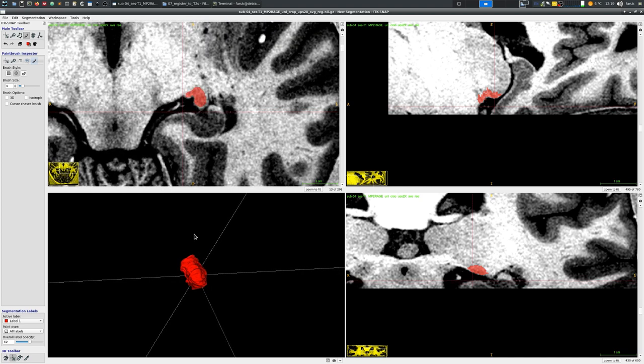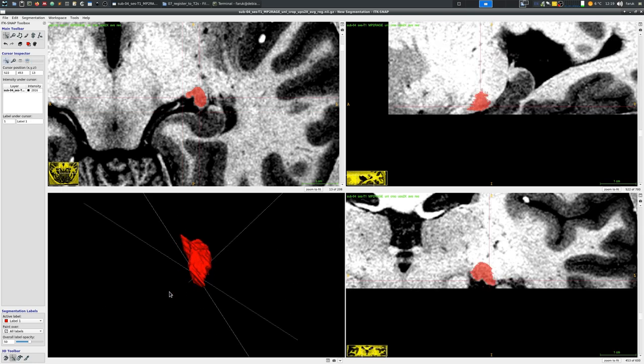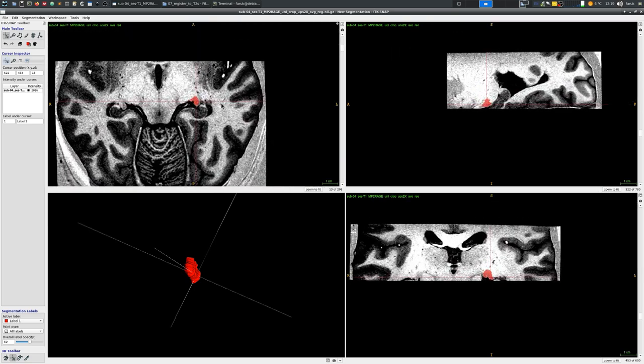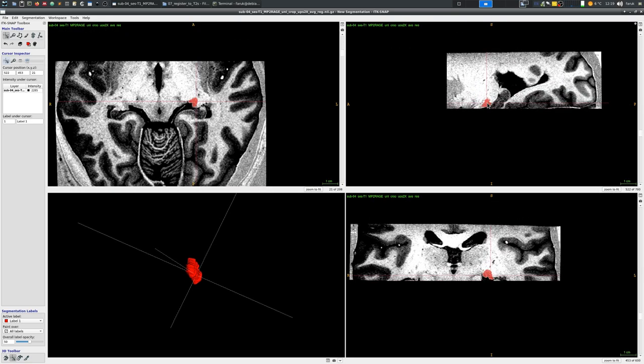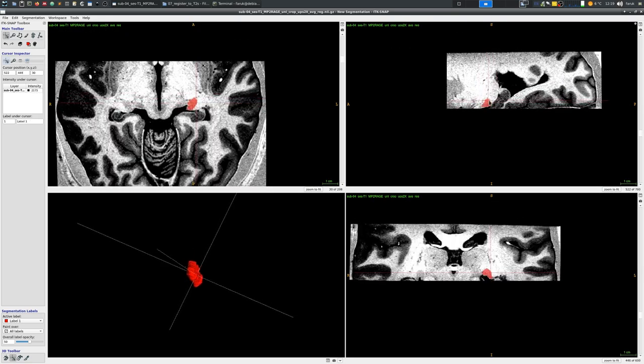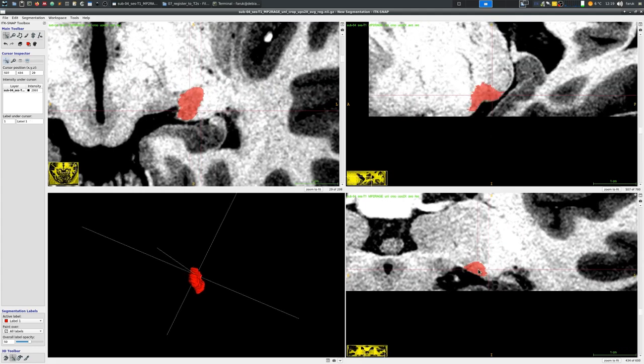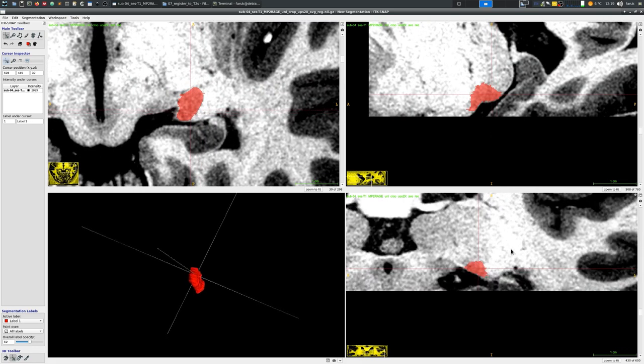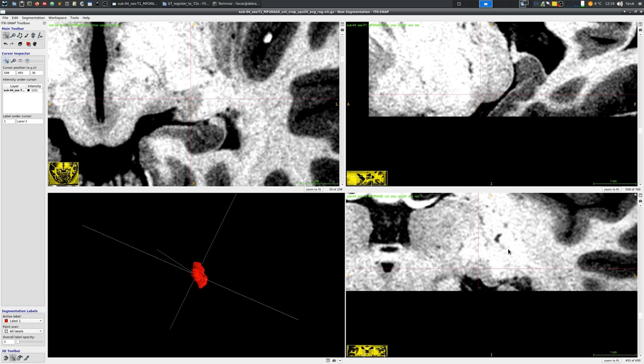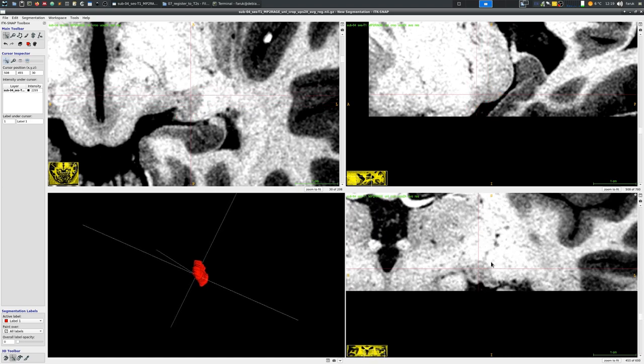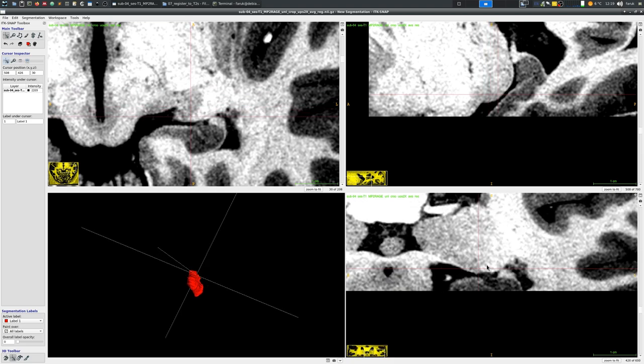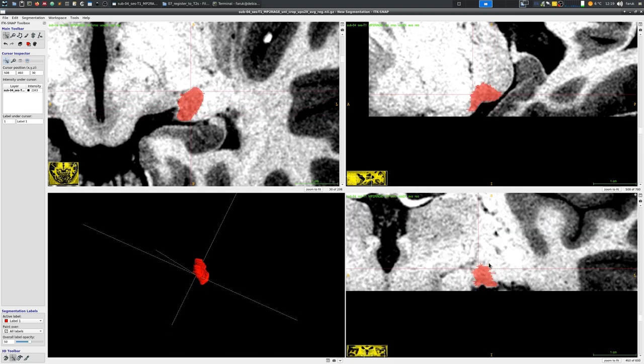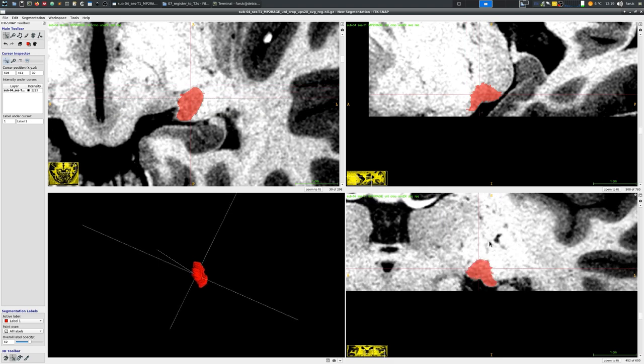Now the rough initial segmentation is done. You can see that there are some edges but overall LGN is covered and I'm not going to go further in this video. There are many other methods to smooth it and make the borders better fit to the underlying contrast but here you can see that I am just checking with and without the labeled area going through in different perspectives.